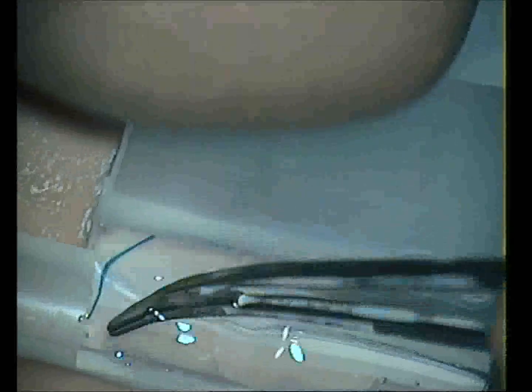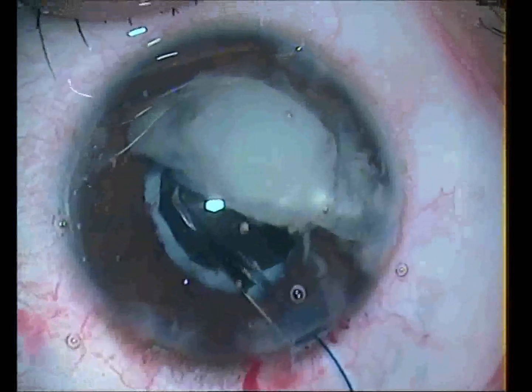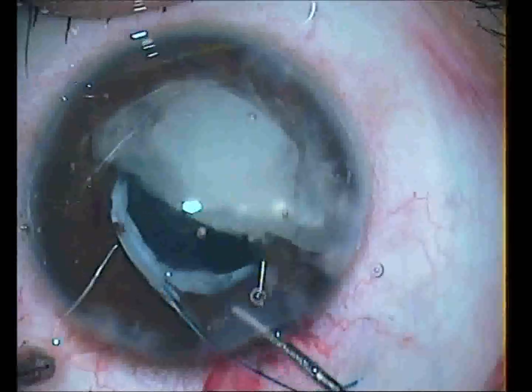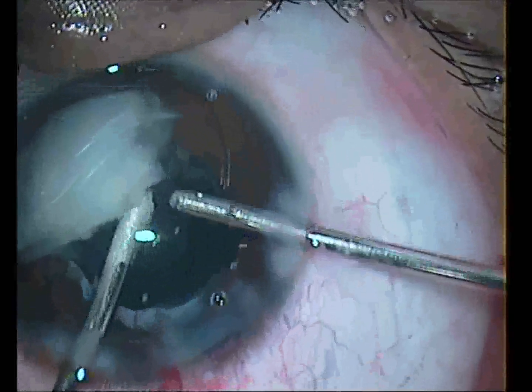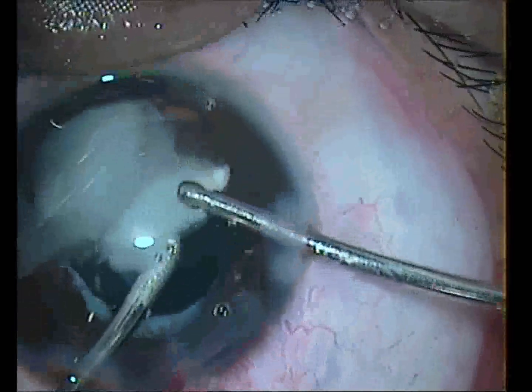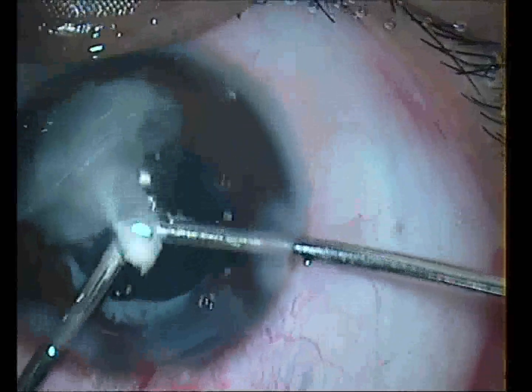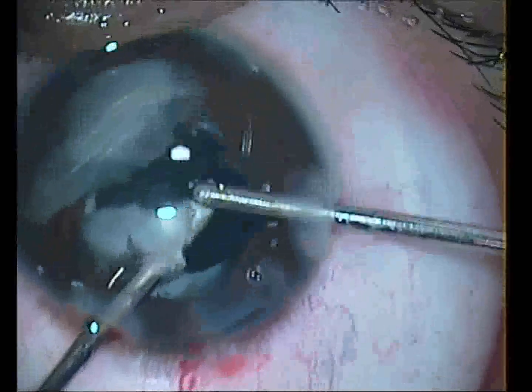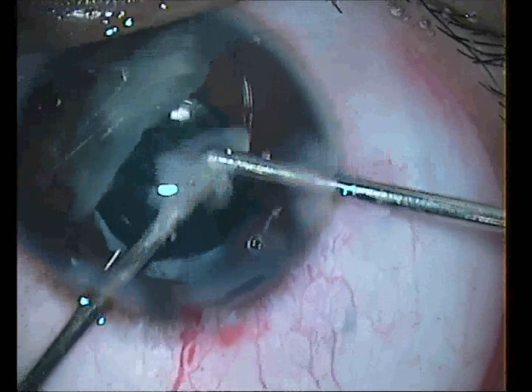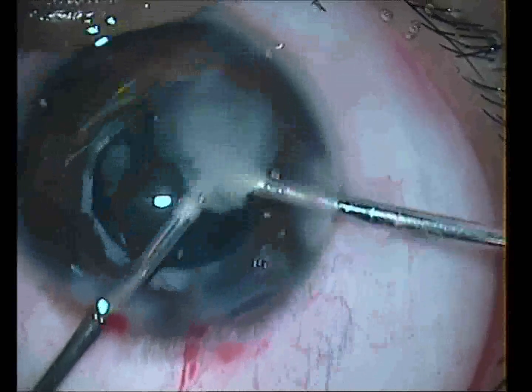So to keep the vitreous away, we have done an IOL scaffold. This is one of the good methods where you want to keep a barrier between the two parts of the eye so that the anterior part remains separate from the posterior part, and the posterior part which has got vitreous does not come into the anterior part where you are going to emulsify or aspirate the soft nucleus, which is being done in this case.